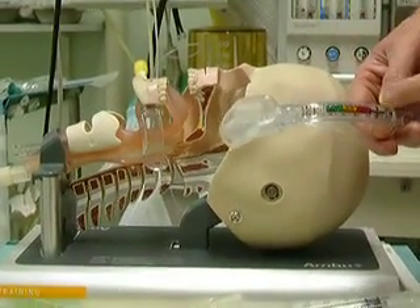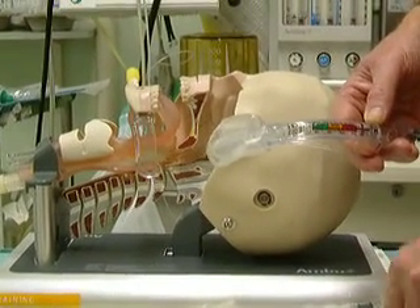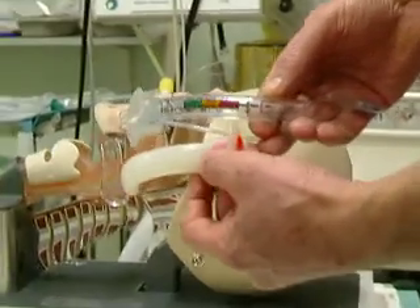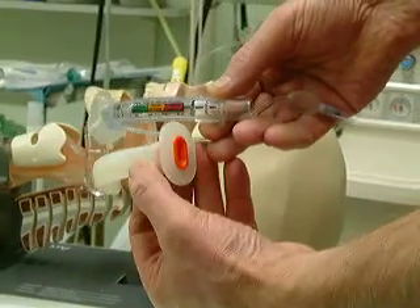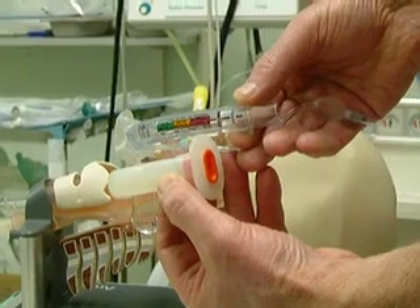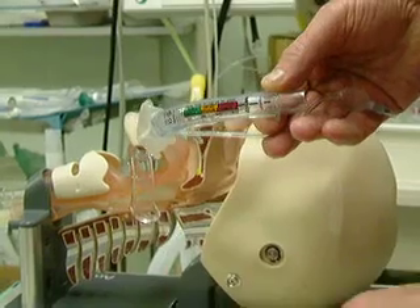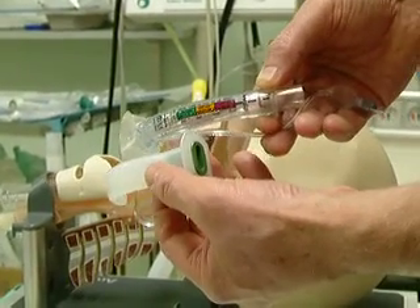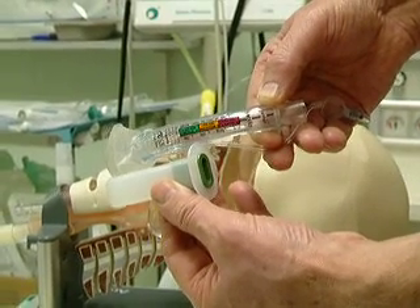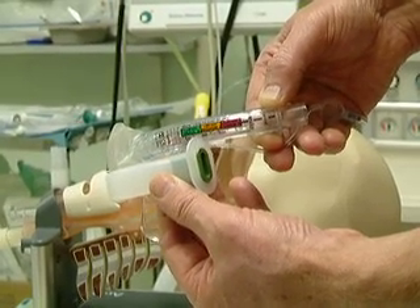It has a cup and a tube and is marked to assist with sizing relative to the Guedel airway. The red, for example — the top of the red is equivalent to a red Guedel airway, and if we choose a green, the top of the green corresponds equivalently to the size of the green Guedel airway.